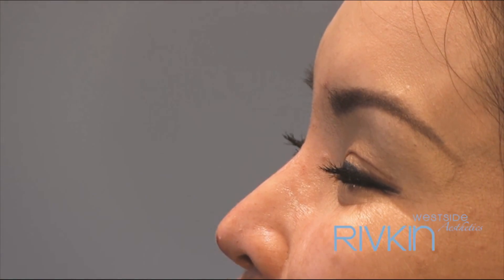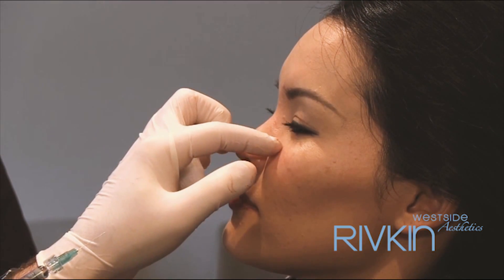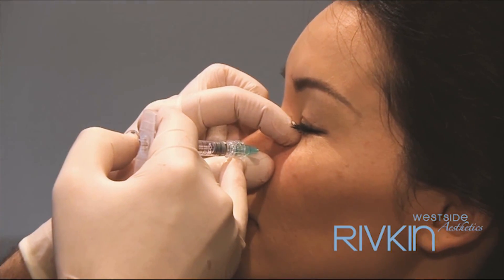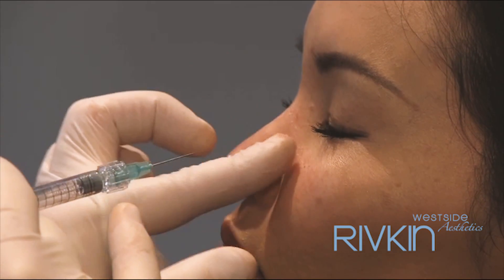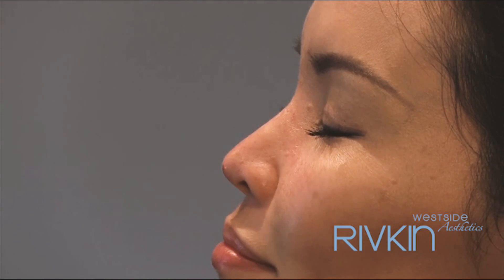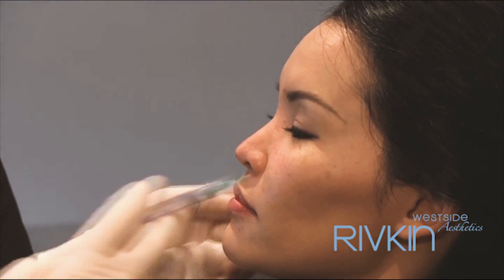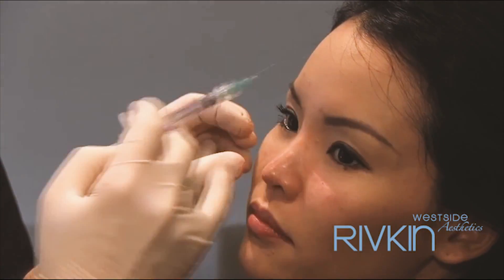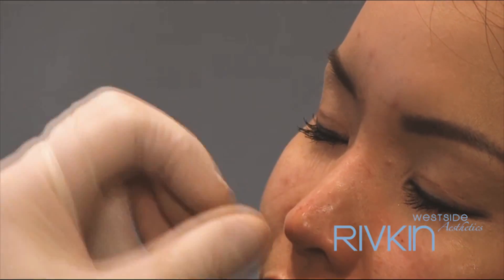Ok, smile. And relax, that's good. Ok, good — one more. That's it. Good, that's better actually. Relax. I don't see that line coming down anymore. Just have a little touch left, I'll put it right in here to the left. Good, alright, good job.